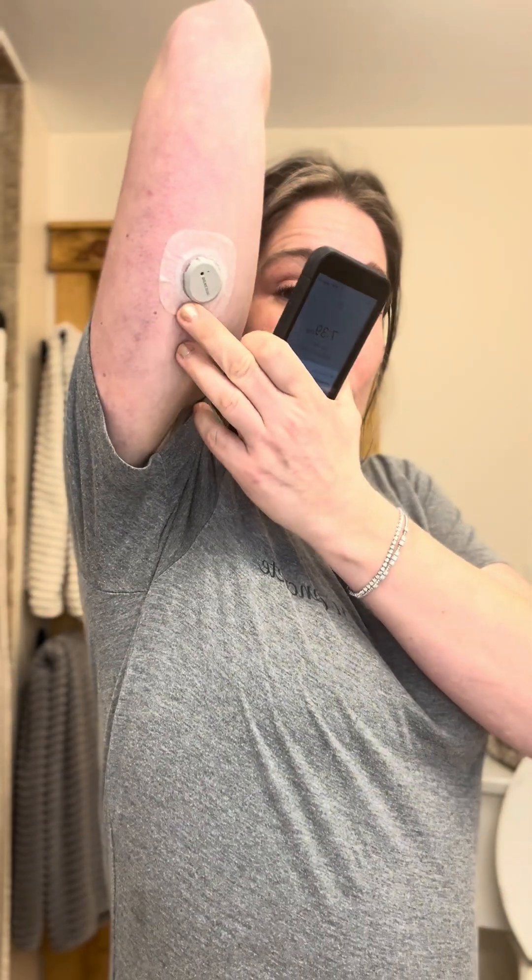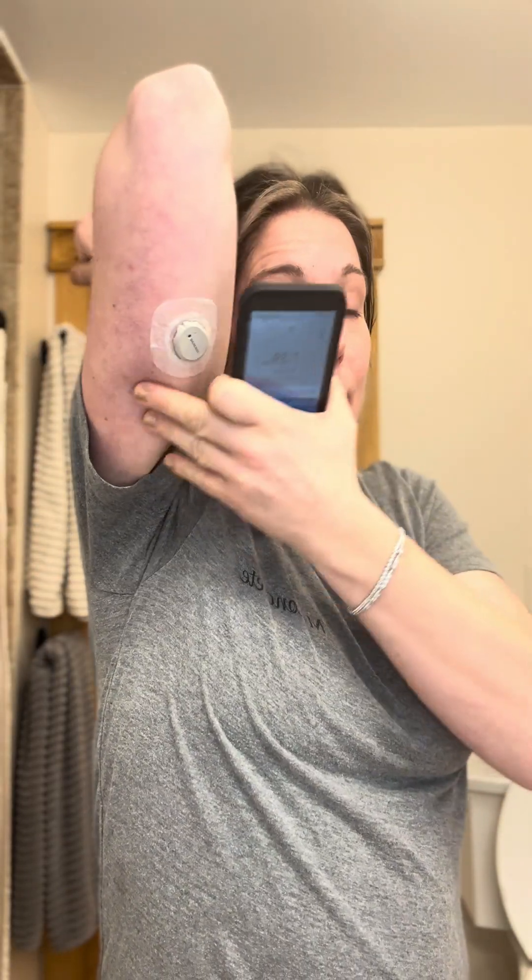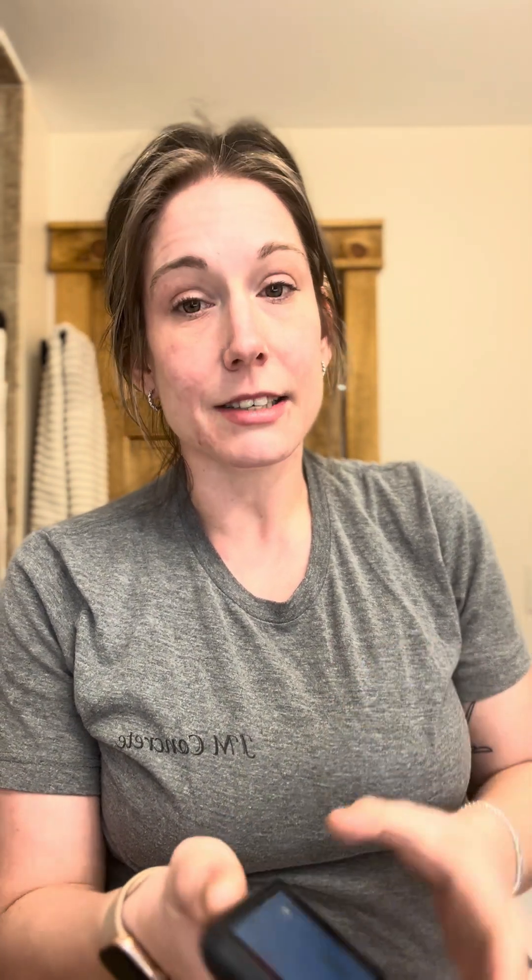So I just put my new Dexcom on right here. I put the alcohol swab, cleaned my arm, put the new one on, and right now I'm in sensor warm-up stage through my iPhone. But I need to set it up on my Omnipod receiver so that way it gets the best readings.